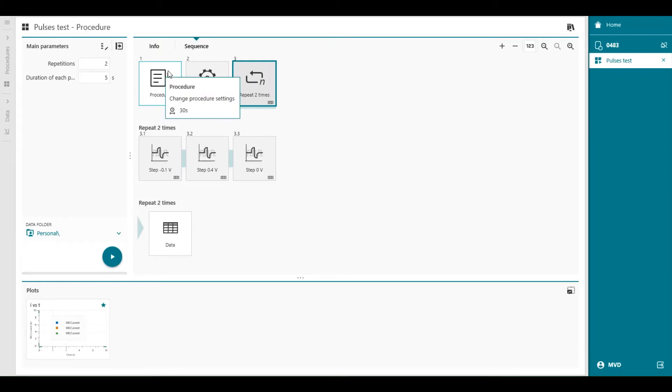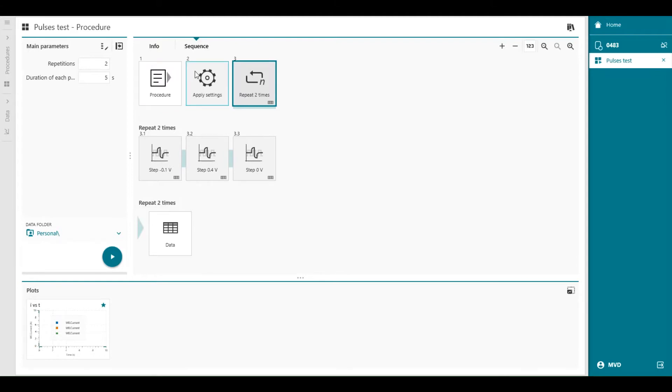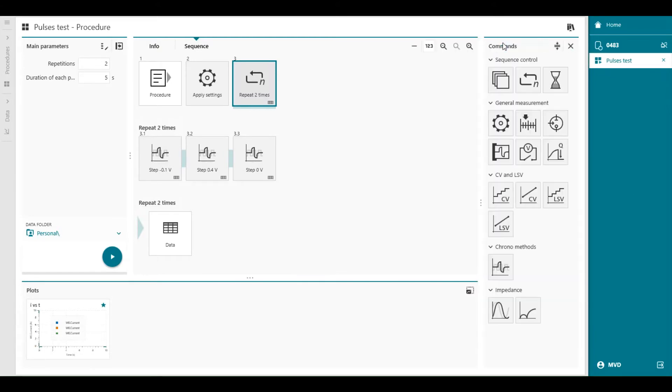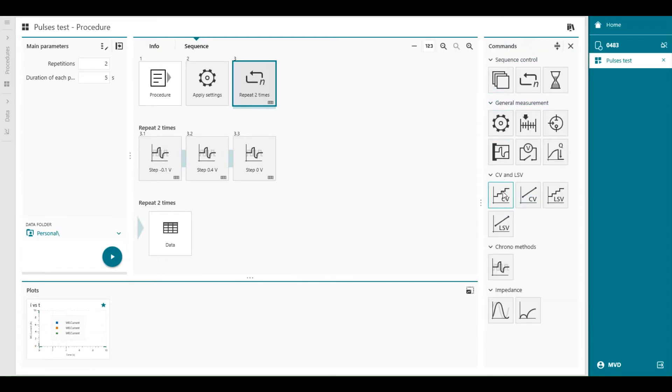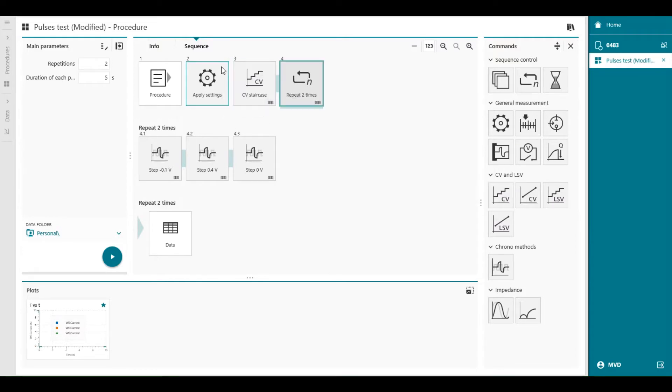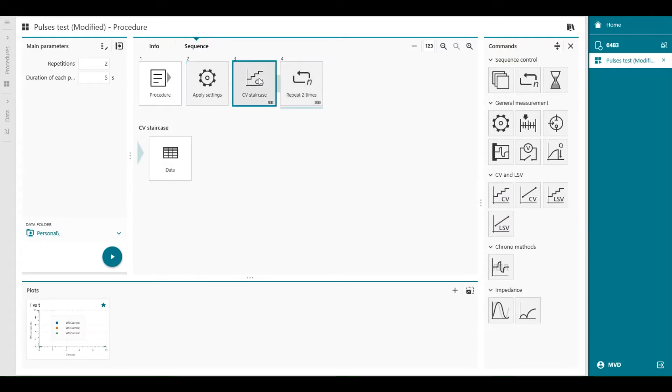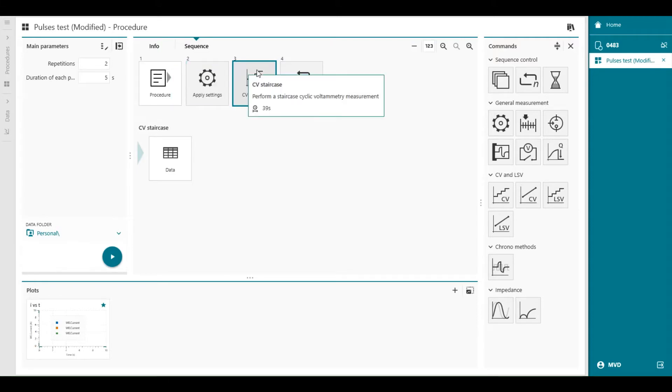Let's say we decide that our results will be better when we do a few cyclic voltammetry cycles before the pulses to clean the electrode. We can modify this procedure to make it more suitable for our experiment. Add the staircase CV command to the sequence, right before the repeat loop. So we press the plus button, and here we'll find CV staircase. And this we can drag and drop just before the repeat loop. You can also see that the numbers are changed automatically.